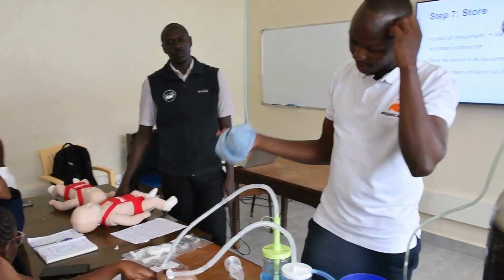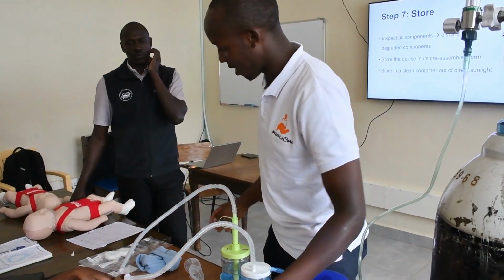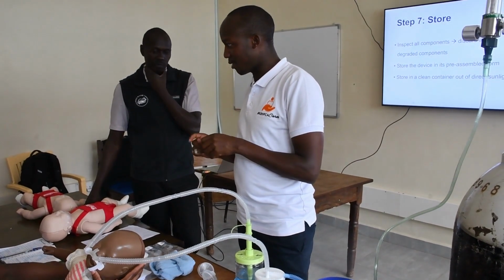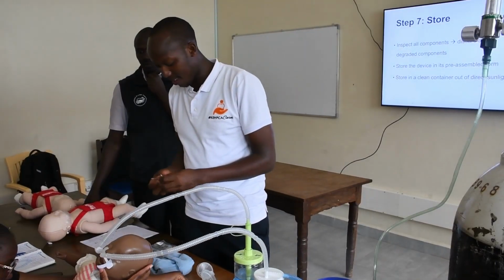So we go to the next step, we get our safety pins.